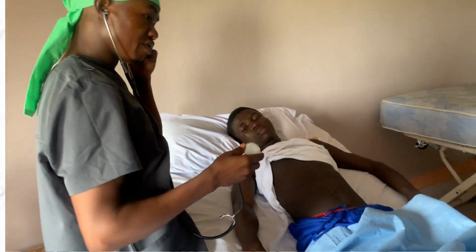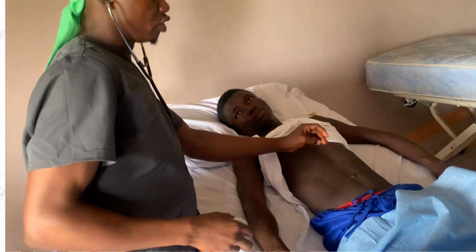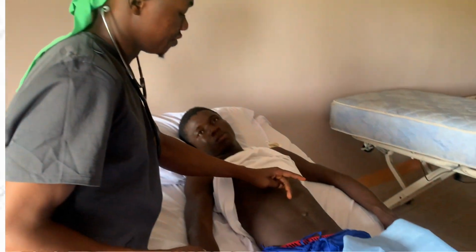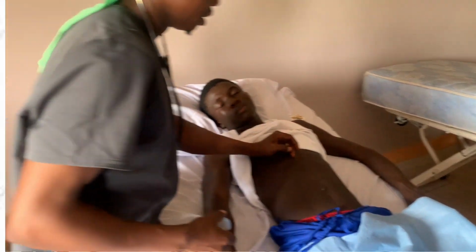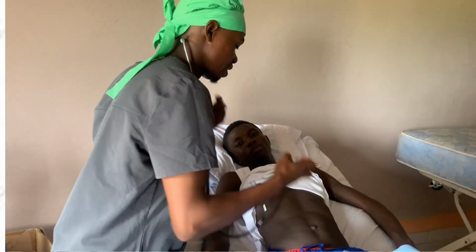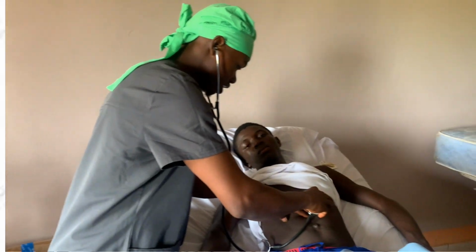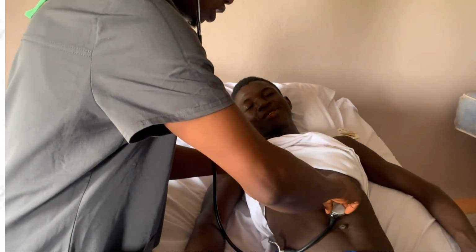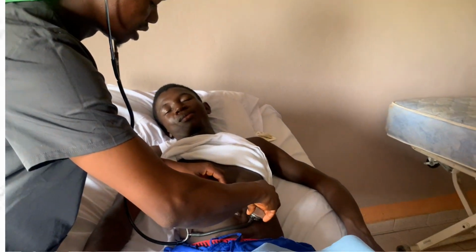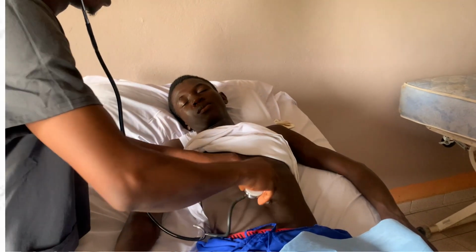During the vascular auscultation, we are starting with the aortic artery, just below the sternum, above the navel. Then we auscultate using the diaphragm of our stethoscope. That is found around here. That is the aortic artery. From the aortic, we are coming to the renal artery, laterally by the side of the navel.